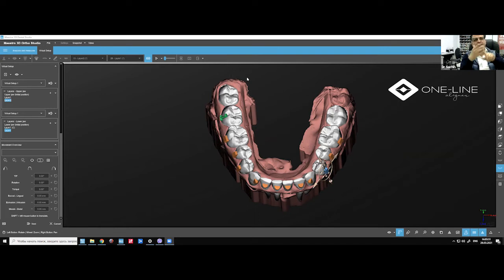You need to see the bone. You need to see the form. Maybe if possible, you can see the CBCT. You can see the shape of the root as well. A root which is conical, it'll move easily. If you have a figure of 8, oval, or with a depression on the root, it's going to move very slowly. Okay, with time you can see all of these and you will get to know. Per se, we can say like this.